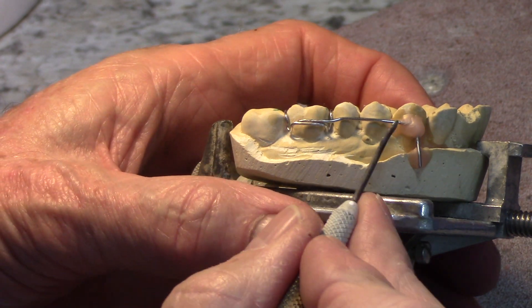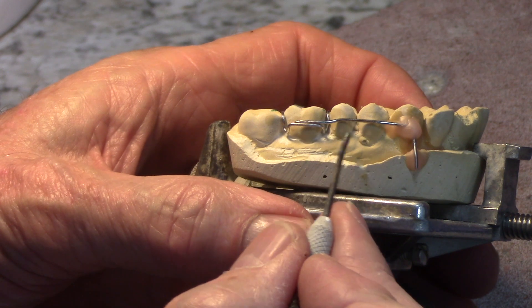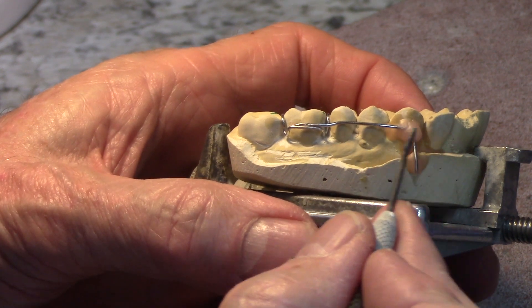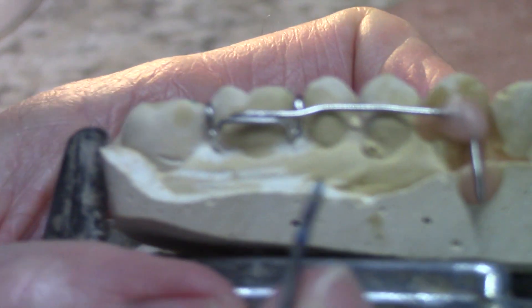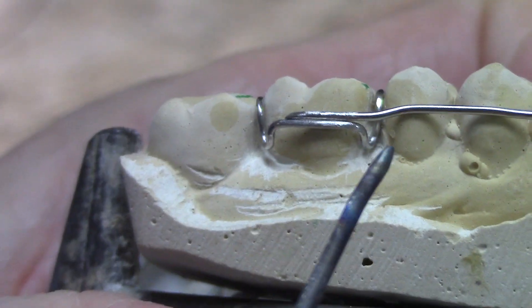This is a mock-up of a labial bow soldered to an Adam's clasp — just for this video. Imagine this being a labial bow; it comes up here and it's going to be soldered to this Adam's clasp. I'm going to pull it in close so we can take a good close look at it.